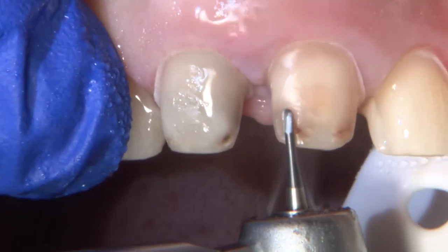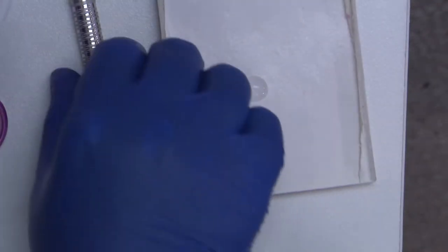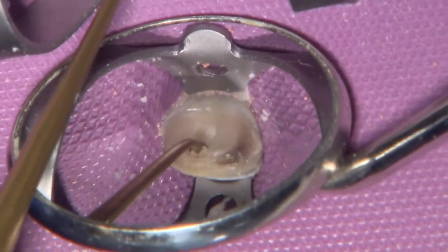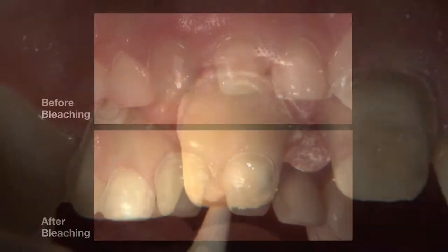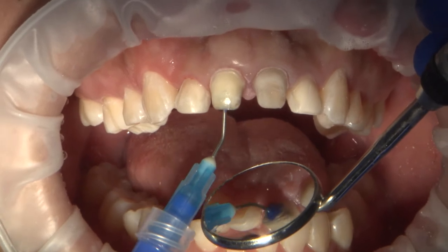For comparison, I decided to do internal bleaching on number 8 and removal of carious tissue followed by external bleaching on number 9. To fill the cavity, I used Thi-Core flowable composite. For the internal bleaching procedure, I prepared a slurry mixture of sodium perborate particles with a drop of anesthetic mixed to a wet sand consistency. The canal just apical to the gingival margin was sealed with Cavit, then the pulp chamber was packed with the bleaching paste. The remaining 2 to 3 mm were also sealed with Cavit, and the patient was temporized and scheduled to return in another two weeks for the external bleaching on number 9. After adequate bleaching was achieved on number 8, Opalescence Boost in-office whitening gel was used for the external bleaching of number 9. The Cavit and sodium perborate bleaching paste was removed from the right central incisor, the excess cavity was cleaned and prepared to be obturated with Thi-Core flowable composite to restore the tooth structure and provide a good seal.